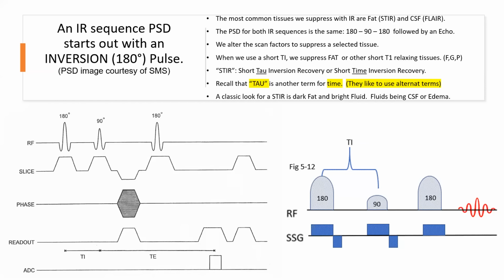So over on the right-hand side is my version of an inversion recovery pulse sequence. It's a little crude, but it gets the job done. Over on the left-hand side, that might be more what you're probably going to see. I don't know if they'll take it right from Siemens Medical, but it'll be a lot prettier than mine. Okay, so 180, 90, 180. Bingo, that's inversion recovery. You don't know if it's STIR or FLAIR because there's no TI stated. Don't get that particular about it.